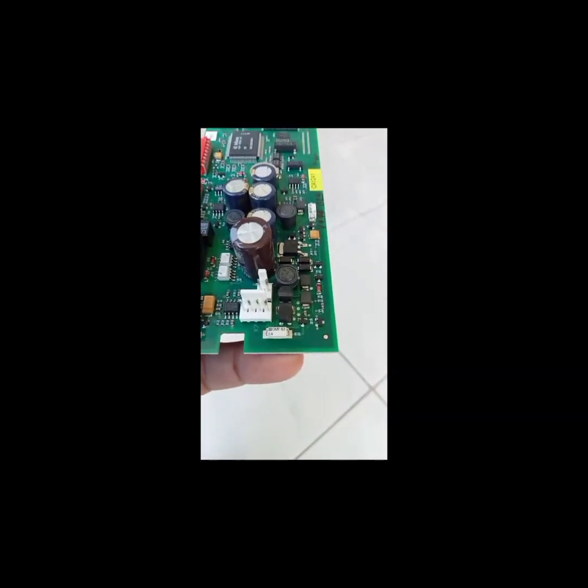And before that, Biomeds, every time you check hospital grade equipment, make sure that you know what you're doing, and please refer to service engineers if in case you have a doubt.